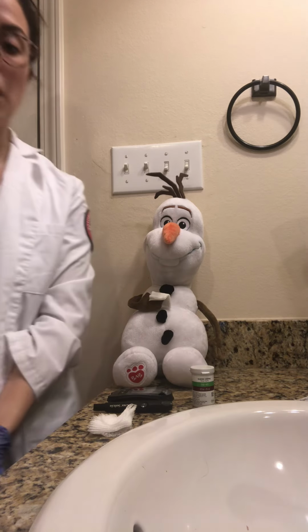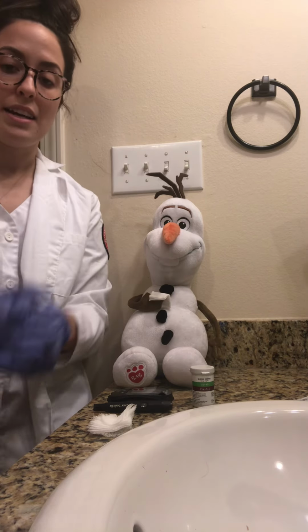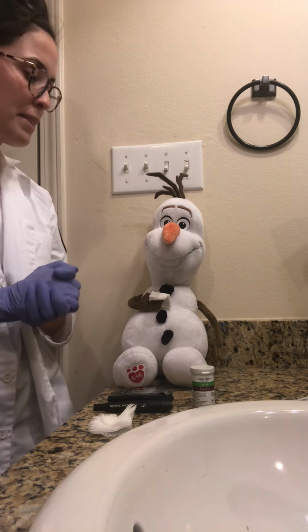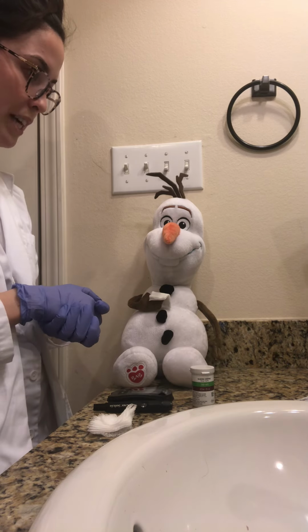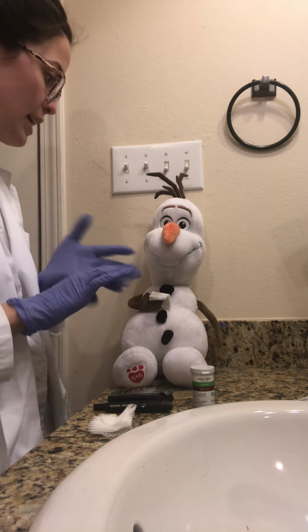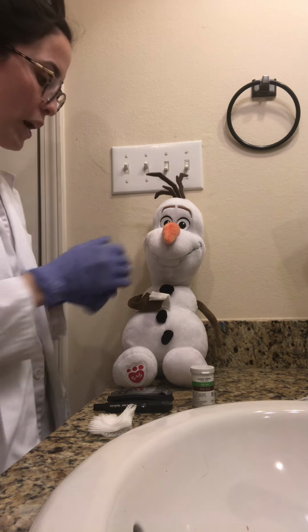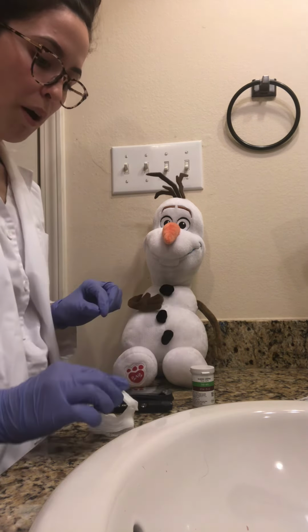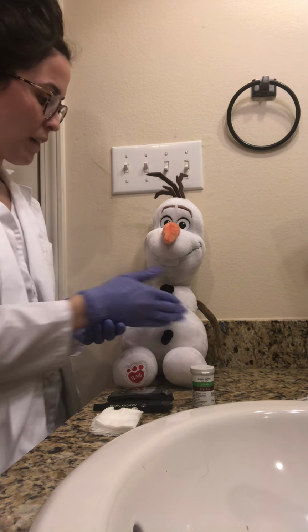Okay, prior to entering the room, I did perform hand hygiene and I put on some gloves. All right, Mr. Olaf, based on your blood sugar level, we are going to have to give you 20 units of regular insulin and 20 units of a longer lasting insulin together. Where did you last receive your previous insulin injection? Okay, it was in your left abdomen?